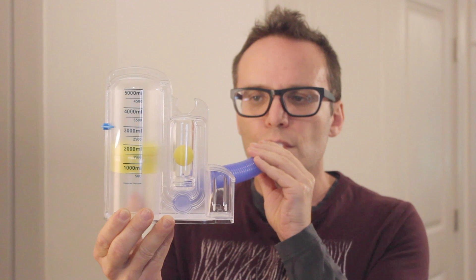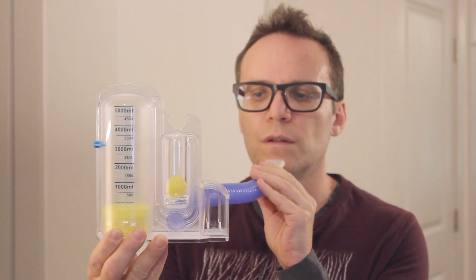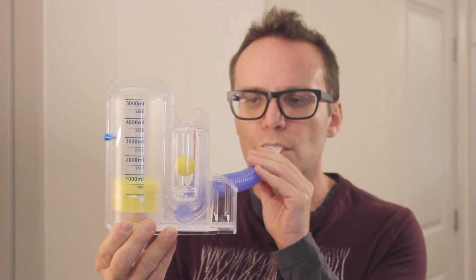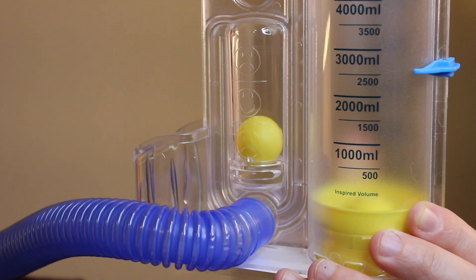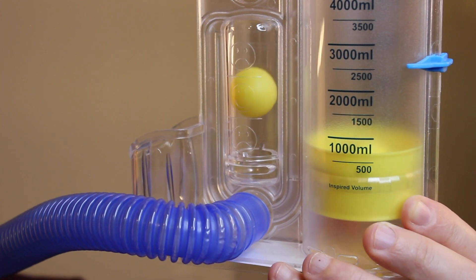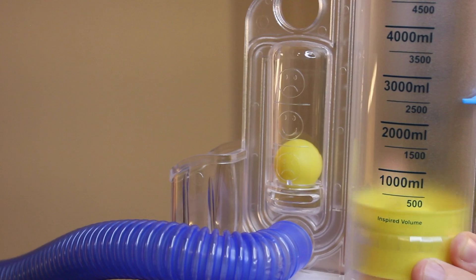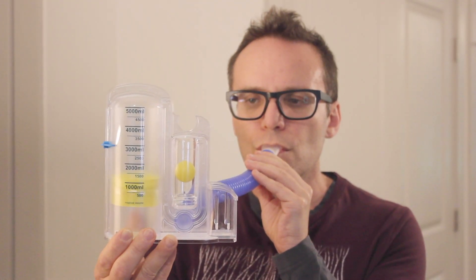Inhale as slowly and deeply as possible. As you breathe in, you'll see the volumetric piston rising in the large column. You'll also see the flow indicator ball rise in the left column — try to keep it in the region with the smiley face. If the ball rises beyond or beneath the smiley face, you're breathing too fast or too slowly.